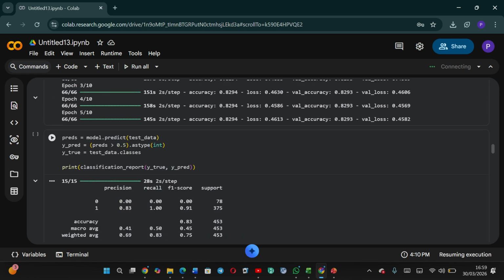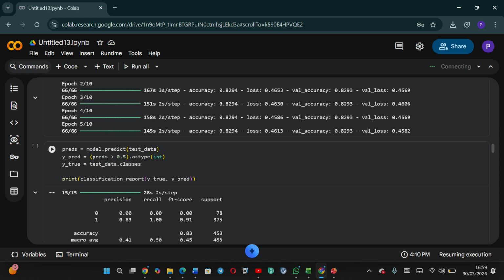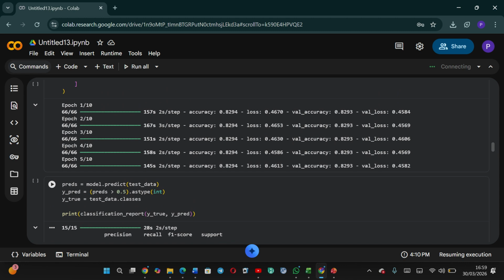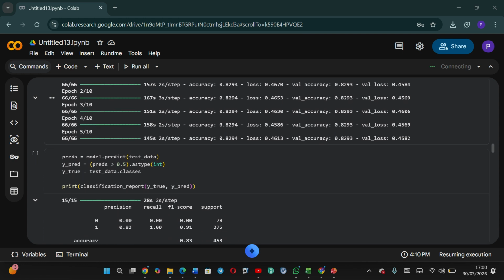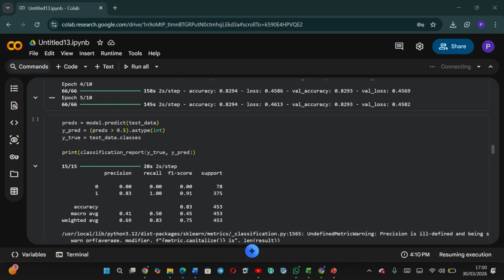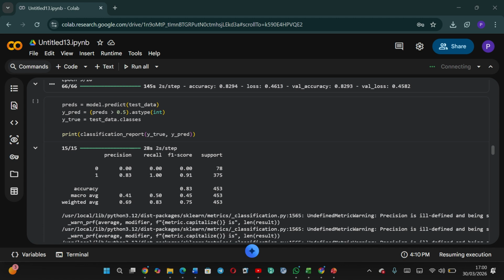Then in our next step, we train the model using the training dataset. Early stopping happened. After training our model, we evaluate it using the test dataset we had earlier. The model predicts results, and we convert probabilities into class labels. Then we use a classification report to measure the performance. This includes accuracy, precision, recall, and F1 score.